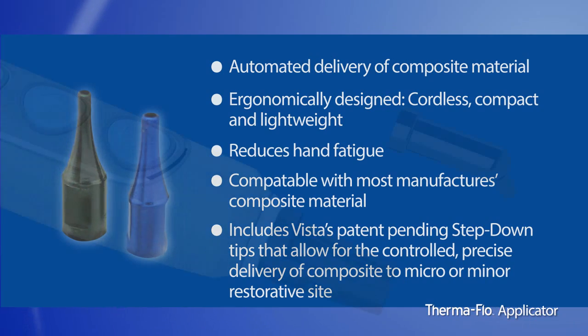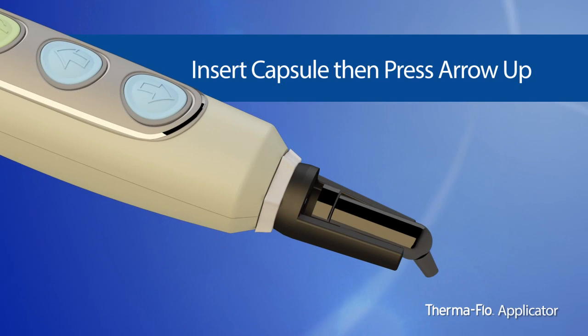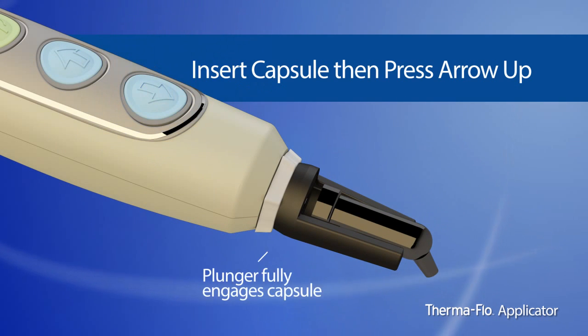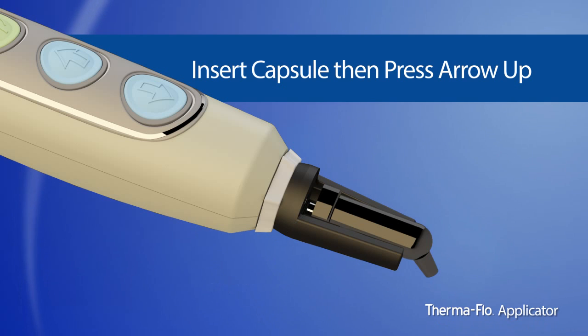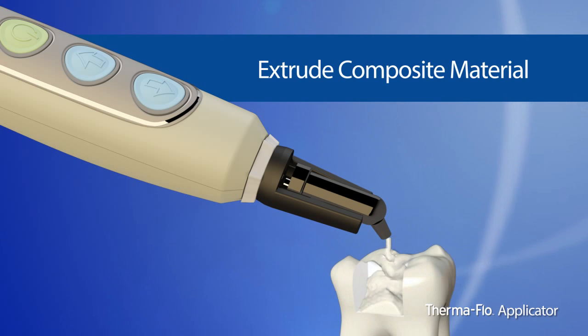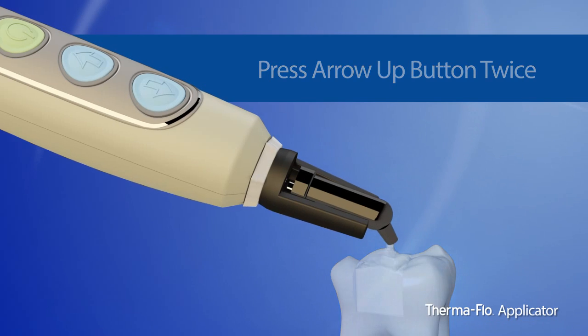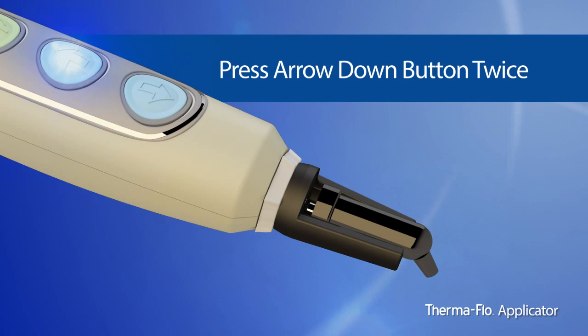To operate the handpiece, insert your preheated capsule in the capsule holder and press the arrow-up button until the handpiece plunger fully engages the capsule. Extrude the desired amount of composite material. To extrude the entire capsule, hit the arrow-up button twice. When the capsule is empty, press the down arrow twice and the handpiece will automatically retract to a ready-to-use position.